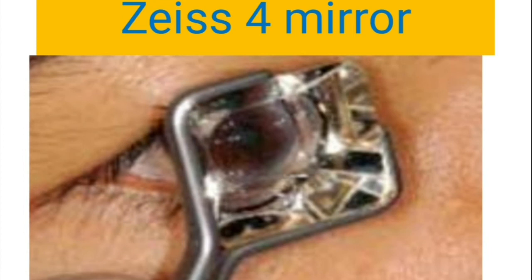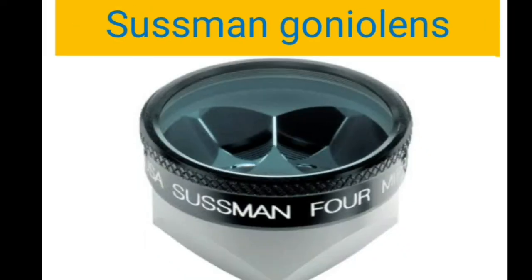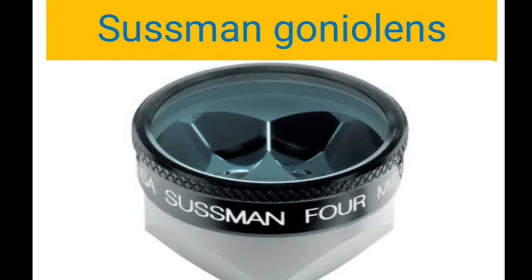Coming to one more type, that is called indentation gonioscopy. This is done using either the ZEISS 4 mirror or POSNER's goniolens or the SUSSMAN lens. To carry out this procedure, the contact area of the goniolens should be less compared to the total diameter of the cornea. So this can't be done using your Goldmann lenses.